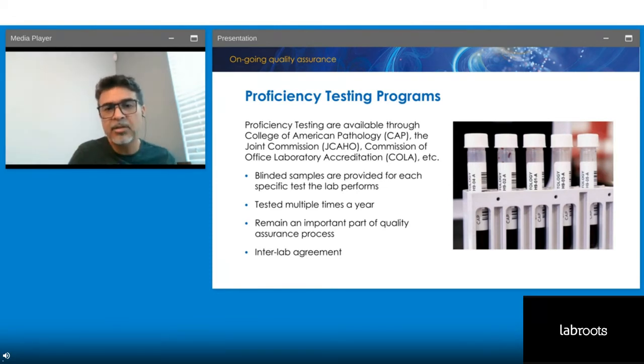And this is important to have as part of the quality assurance process. This is also to guarantee that we are not introducing contaminants, that we are able to identify the organisms that are present in the sample, and that we are able to report or do what we are expecting to do. And to make sure that the whole process not only has a high quality standard, but is also clinically significant when we report it.